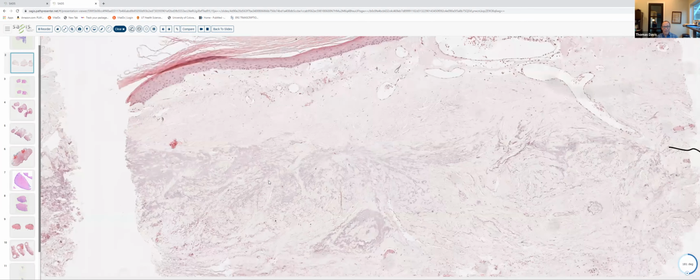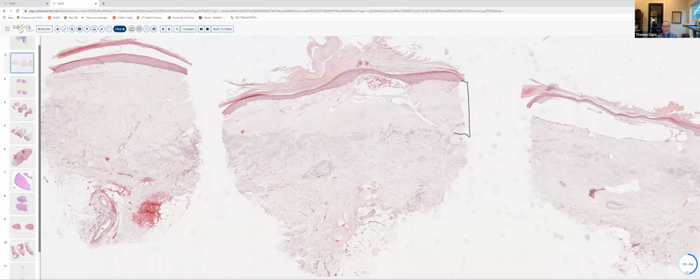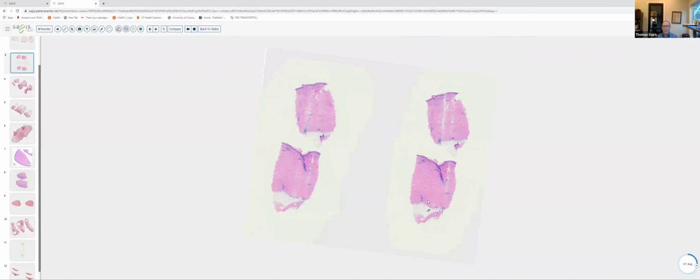the underlying dermis. So a lot of similarity between LS and chronic radiation dermatitis, but again, the absence of an inflammatory infiltrate, the absence of adnexal structures, and the large dilated vessels are all features which are more indicative of chronic radiation dermatitis. Okay, let's go ahead and continue our discussion of sclerosis.